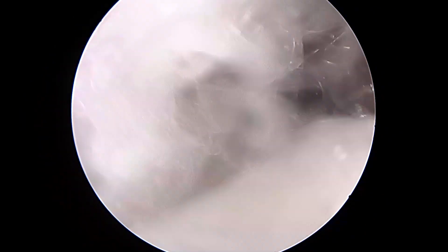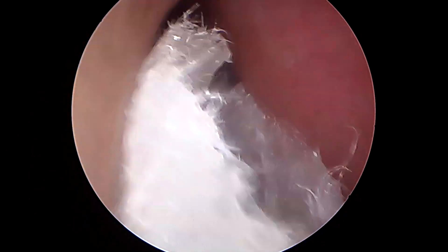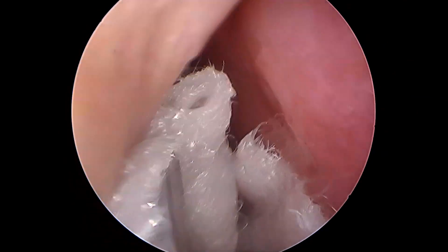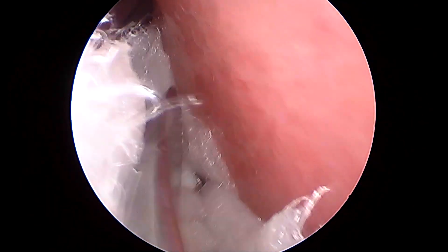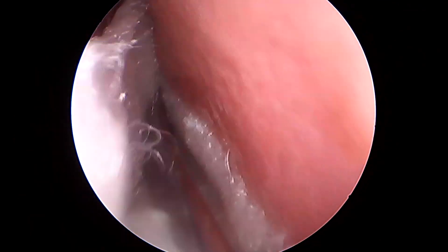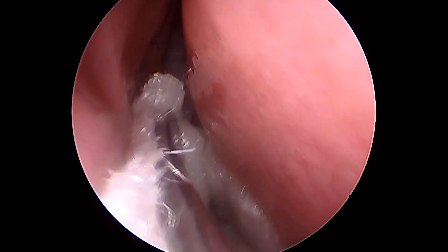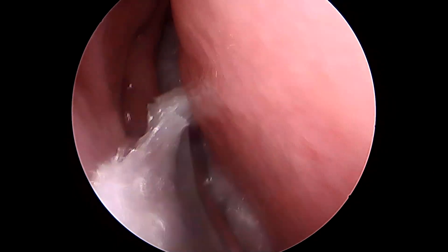You can see it's coming in between, so to prevent any nasal mucosal damage, I will decongest that particular area. This is a very important step. This is a nasal patty soaked in a solution of 4% LOX — that is the numbing anesthetic solution — along with two ampules of adrenaline.